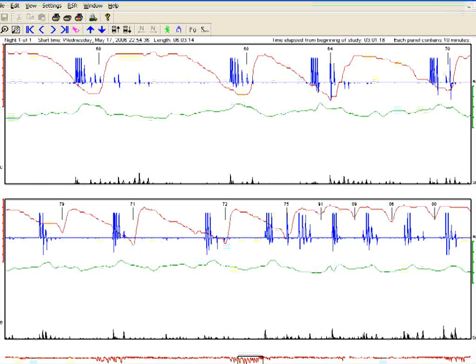And these are the types of reports that you get when you evaluate these things and look at the software. And like Guy said, we like pretty much all of them, and you just have to consider some of those things. And the one thing you didn't mention, Guy, though, was the ability to upload and have these things done through the cloud, so to speak. And some of them have much more user-friendly interfaces to do that.